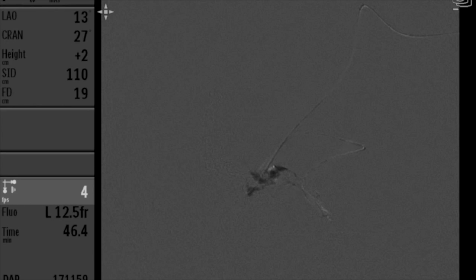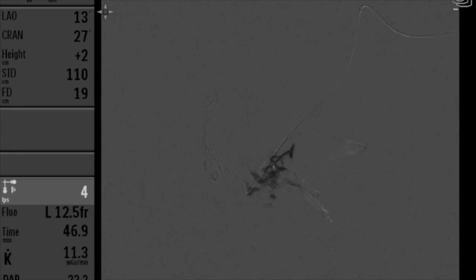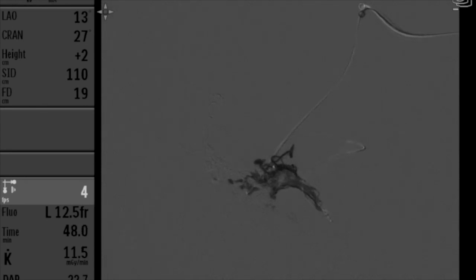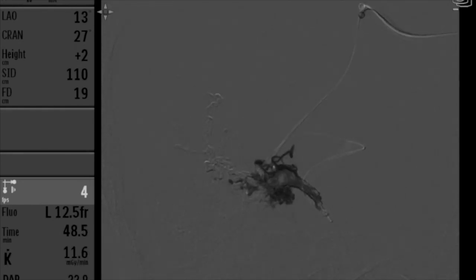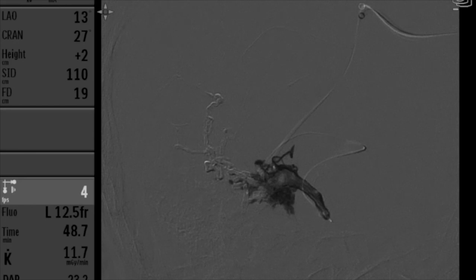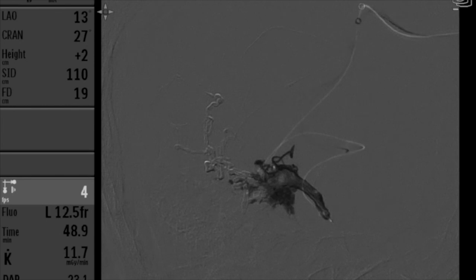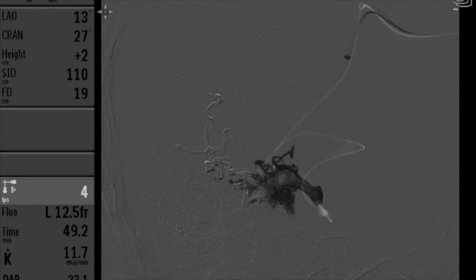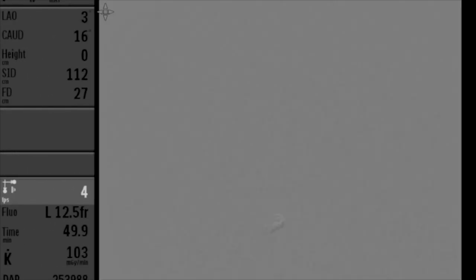We are allowing some reflux into the microcatheter to also obtain some occlusion of the vein. Another angiogram still demonstrates residual fistula. We inject a little bit more onyx to complete the obliteration. Once we have sufficient venous reflux, we slowly pull the microcatheter. The onyx cast moves slightly as we pull, and the microcatheter may take some time to release — in this case it came out nicely.